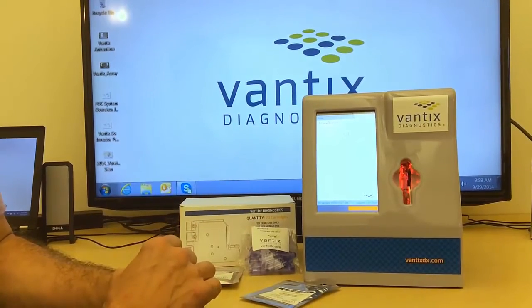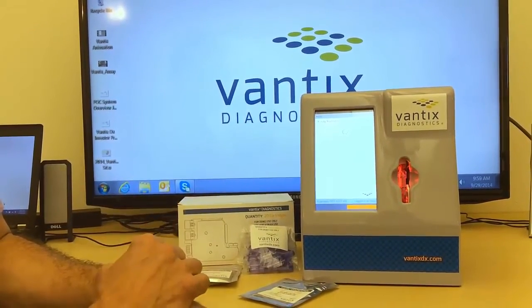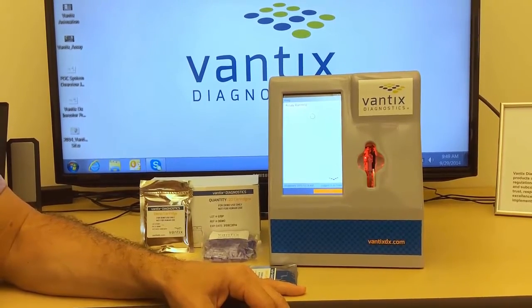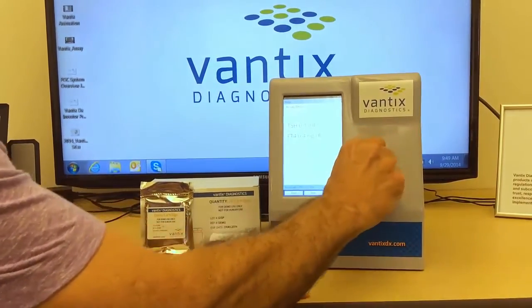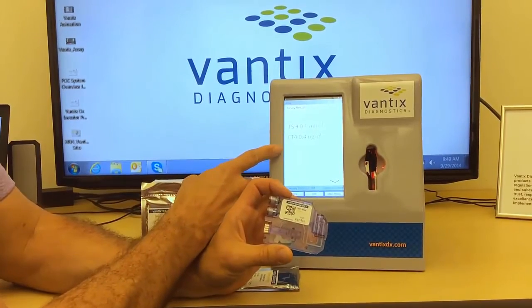We are going to stop the video now instead of waiting the five minutes for the assay to run, and we will come back when the assay is completed. When the assay is completed, the cartridge is ejected, the assay is run, and the results are reported onto the screen.